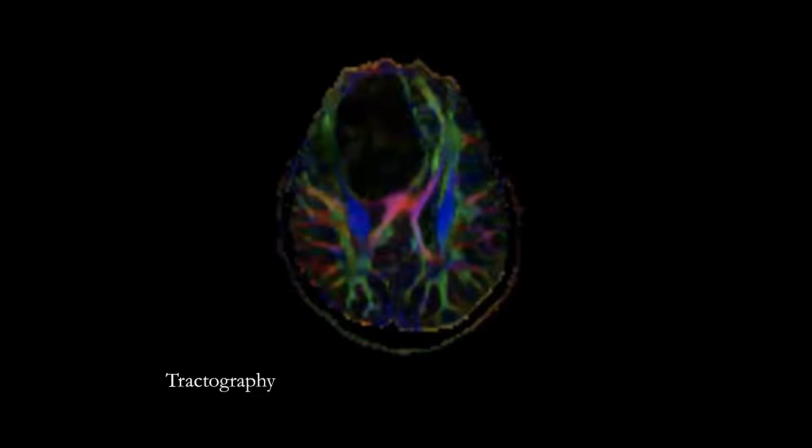This is the last sequence we are going to see, which shows again a very huge mass which is disrupting the fibers around. But we can see again that there is no infiltration. This is a very beautiful image because it shows the direction of the fibers in the brain. According to the color of the fibers, we can understand their direction. For example, the green color means that the fibers are oriented on the y-axis, the red on the x-axis, and the blue on the z-axis. So we can easily understand the position of the fibers just by looking at the color.